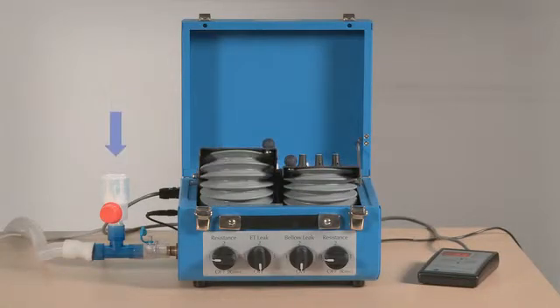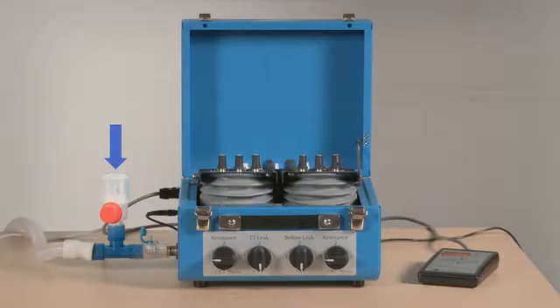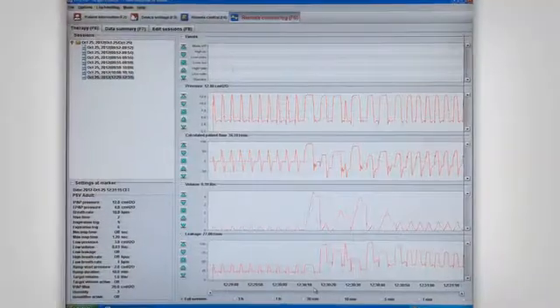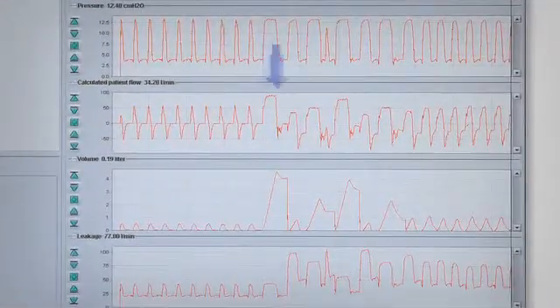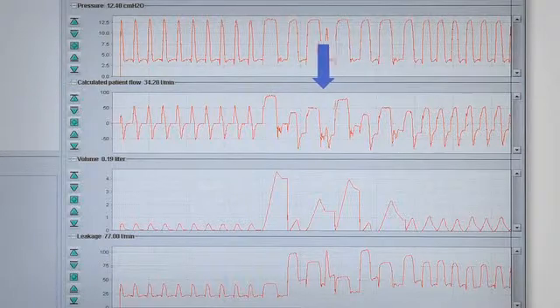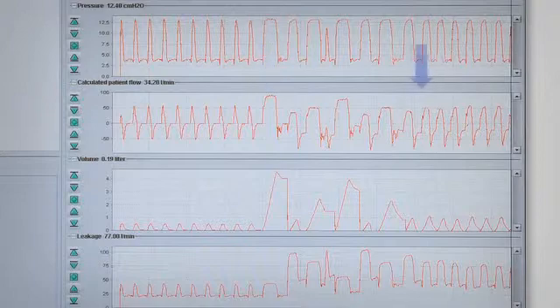We can reproduce this situation in the simulator by adding an inspiratory leak in the circuit with the help of a T-piece and a threshold valve with a resistance of 10 cm of water. When the valve is excluded, additional leak does not happen. When we open the valve, you can see in the record that the cycles show a delayed end and we can also observe some ineffective breaths between them. If we select a maximum inspiratory time close to the patient's neural time, we can avoid the harmful effects of this delayed cycling.